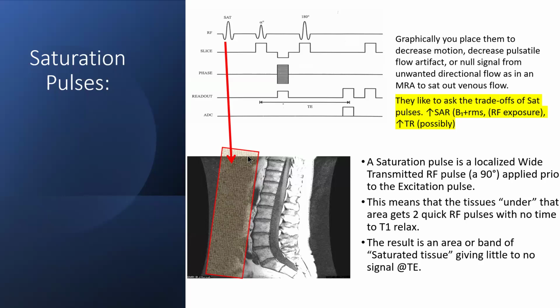What was that? Yes, Aldana, yes. So concats allows you to increase the slices basically without increasing the TR, correct? You got it. But it's a way to maintain contrast. Okay, good point. Is there a downside to increasing concats? Scan time. You still get the same scan time as 1,000 TR, like my example used, 40 slices and 1,000 TR. You still got the 1,000 TR scan time, but you got the 500 TR contrast.